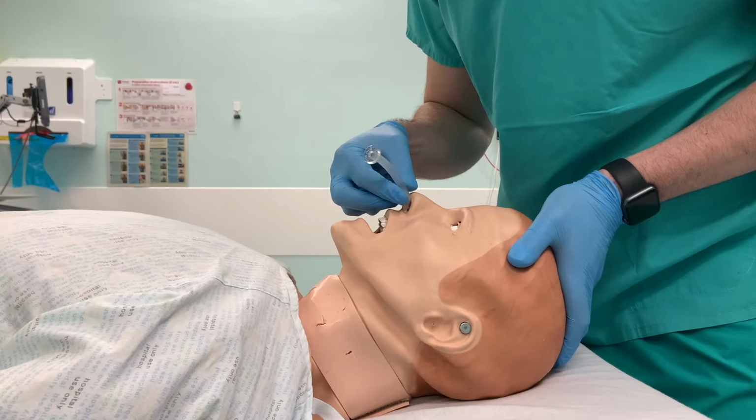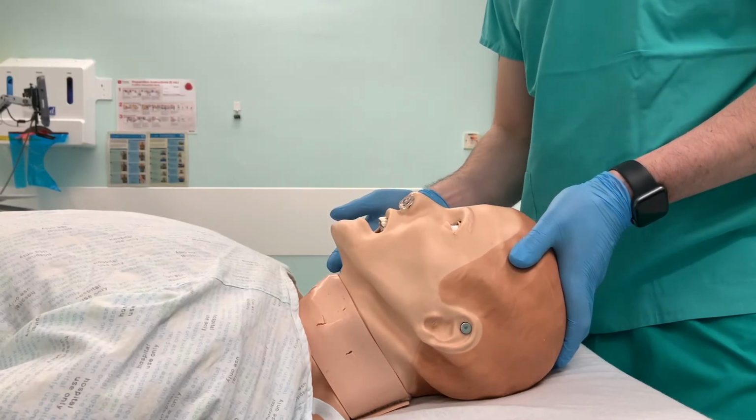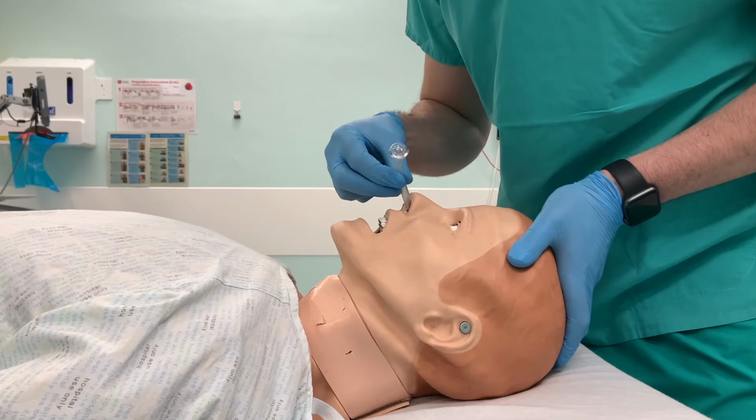In terms of putting these in place, you want to pass them with a little bit of lubricant on the end along the base of the nasal cavity, not pointing upwards towards the brain, but horizontally along the back of the nose. The only significant contraindication to using an NPA is a base of skull fracture, which might be indicated by bruising behind their ears or CSF or blood passing through their nose or ears. If you saw this, then you would at least avoid using an NPA if other airways were still possible.